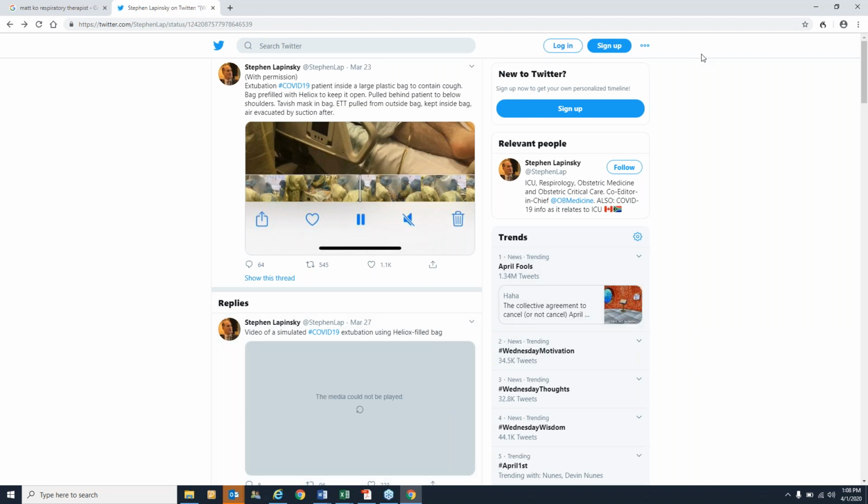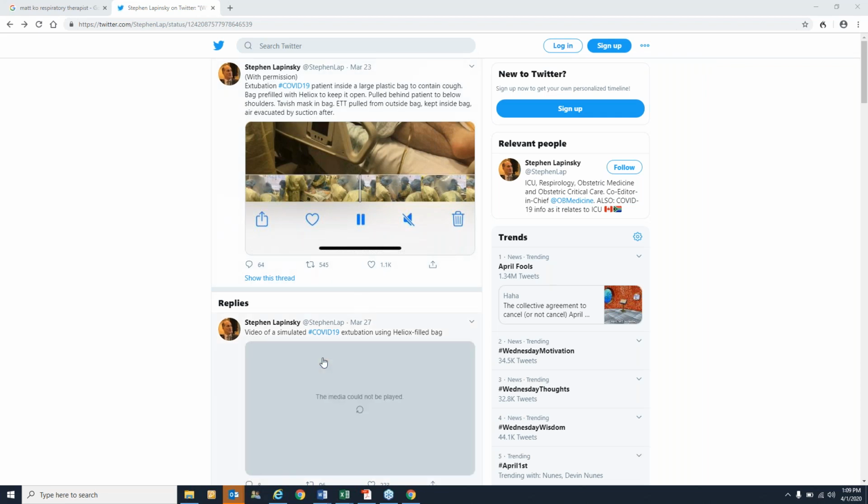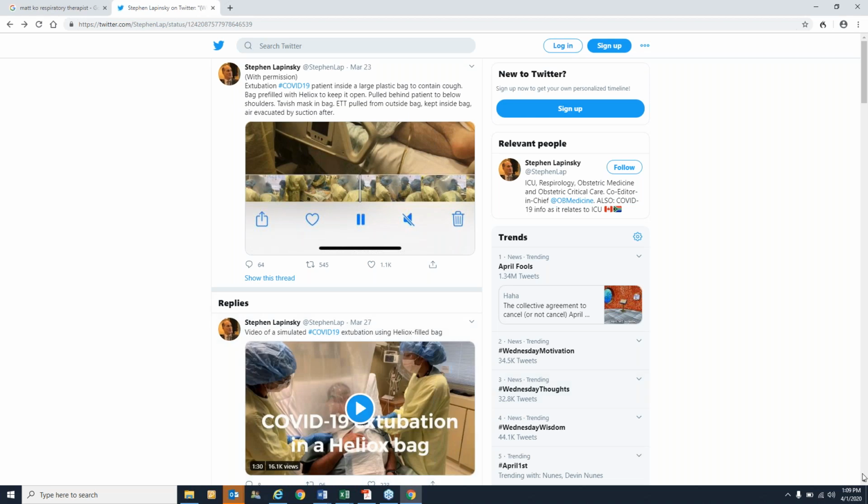Someone says, and I can relate to this because I work in a community hospital, not all community hospitals have access to Heliox. So we just need to be diligent with our proper PPE, and I totally agree. Absolutely. Someone did ask if we can see a photo of the bag at extubation. So maybe you can send us that, Matt, and we can post that. Yeah, I can send you the video of the actual extubation of our patient, who I think has posted it on his own Twitter, so it should be okay to recirculate it. Okay, great. As for the bag itself, if I can tell you the dimensions, it was just the largest clear bag that we had. It's 36 by 50 inches. Okay.